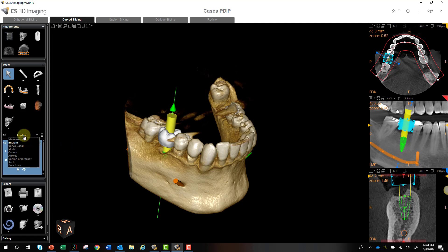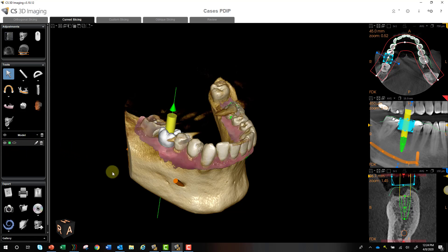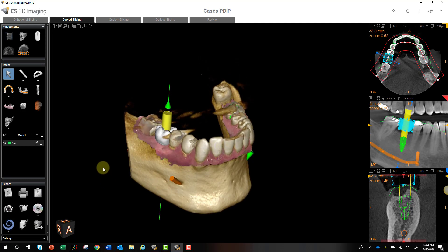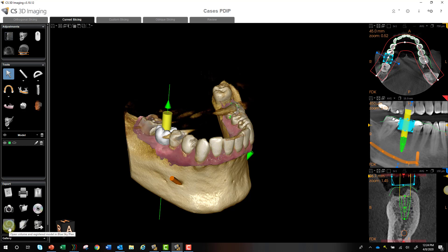Once you have your plan finalized — and you can also merge your digital impression scan — you can freehand your implant placement based on your plan, or if you want to take it to a surgical guide, you can export your data sets and send them to any lab. If you want to design the guide yourself, you have BlueSky planning software available. One single click will launch BlueSky with your full plan attached. Note: the BlueSky icon only shows up if you have BlueSky planning software installed and the PDIP module. Then you can design, export, and print your own guide.